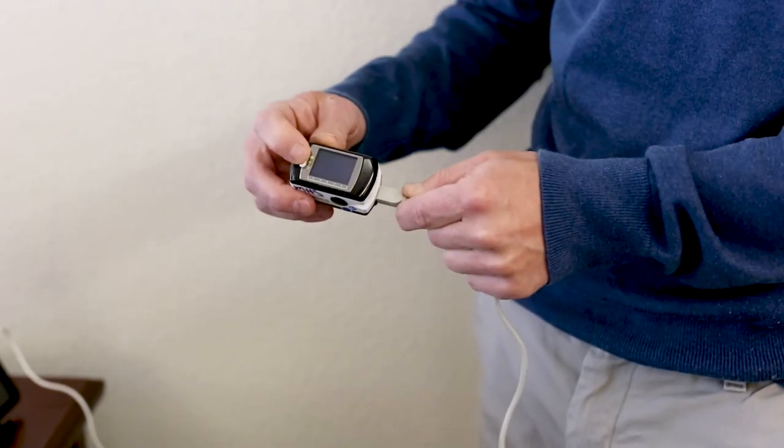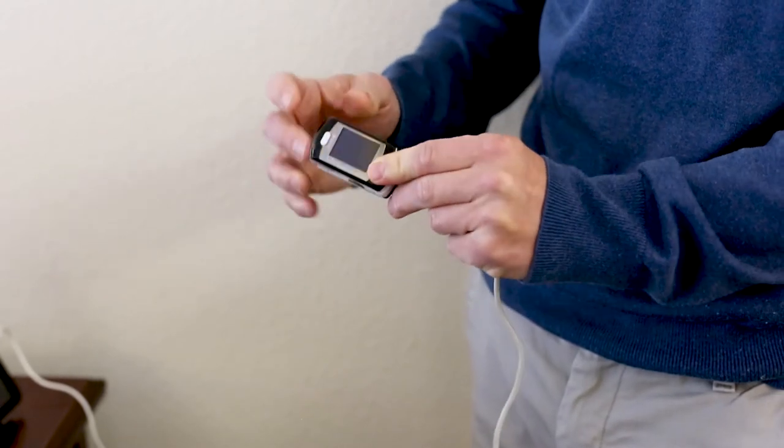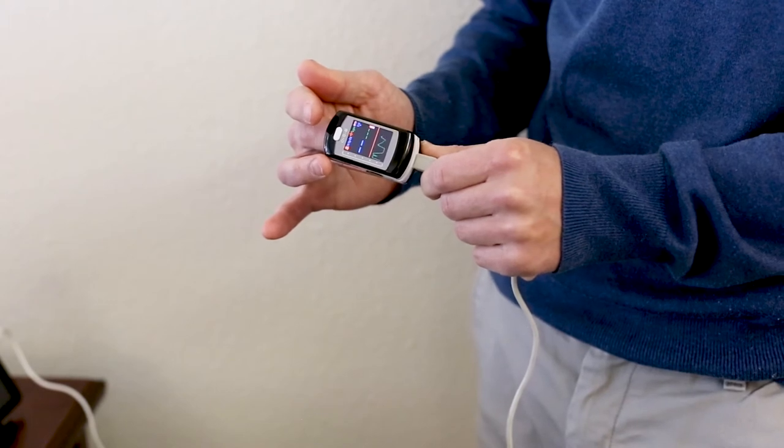A welcome screen will appear, then it will begin taking an oxygen reading. Oximeters will turn off automatically once you have removed it from your finger.